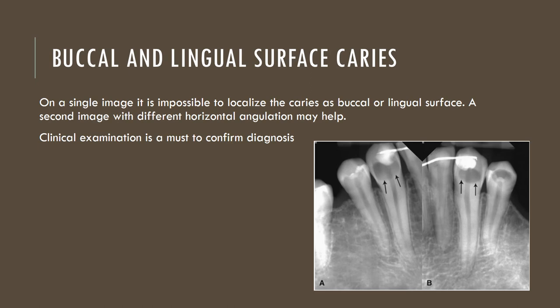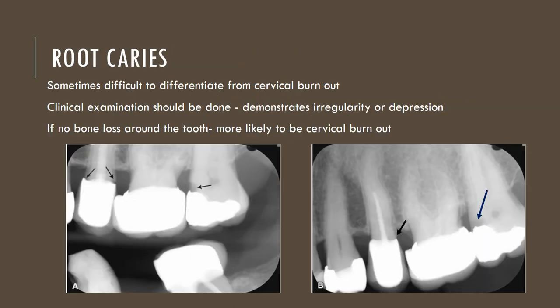Next, buccal and lingual surface caries. On a single image, it is impossible to localize caries as buccal or lingual surface simply because they superimpose over each other. A second image with a different horizontal angulation may help to differentiate. Clinical examination is a must to confirm diagnosis. When it comes to root caries, it may sometimes be difficult to differentiate from cervical burnout, and clinical examination should come in handy.